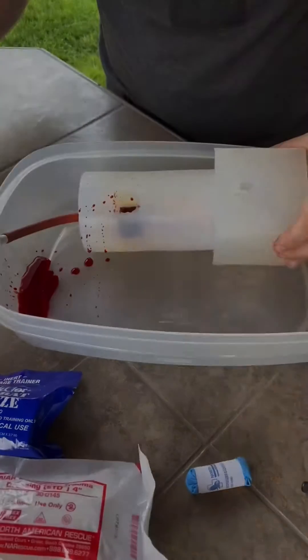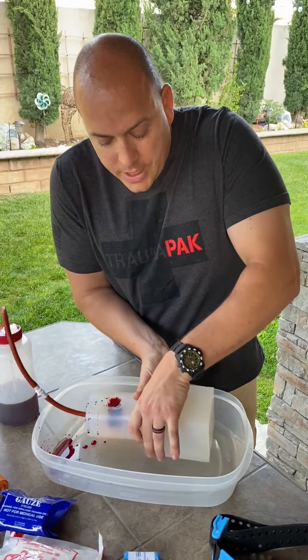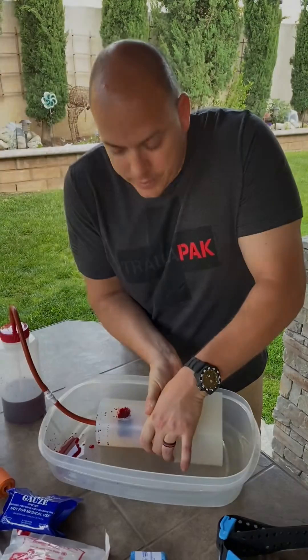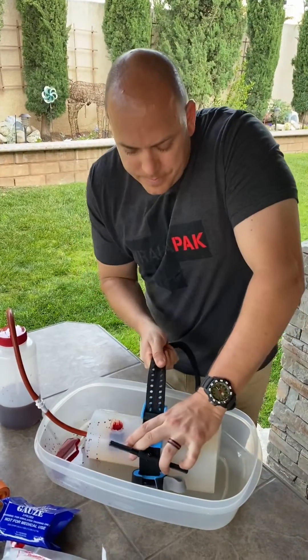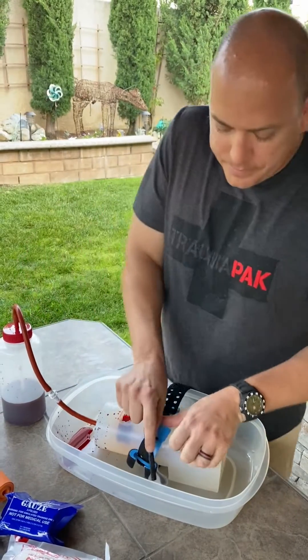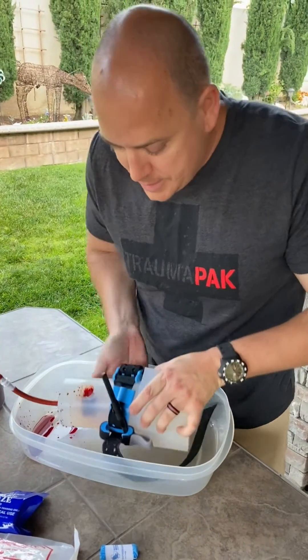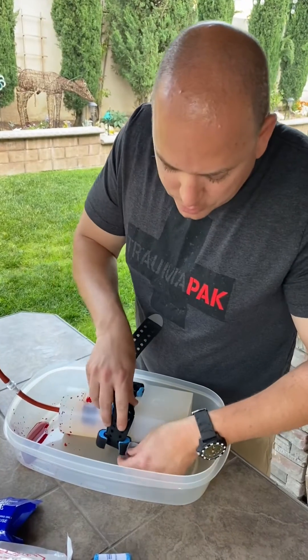This is usually found in the extremity, so you're going to start with direct pressure above the wound, usually pushing on a long bone and the artery onto that long bone, like a brachial artery. Next we're going to go to our primary treatment, which is a tourniquet. I'm not wearing gloves because this is a life and death situation — if I were to take a minute to put gloves on, they may bleed out. So we're not going to put gloves on in that initial phase of care, unless you're an EMS provider and already have them on.